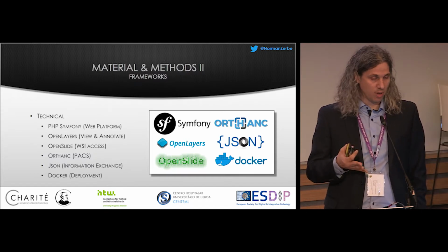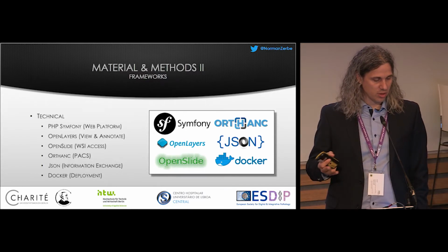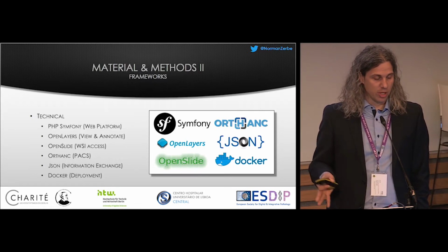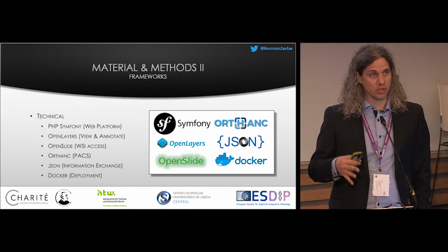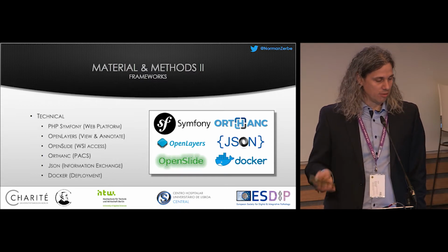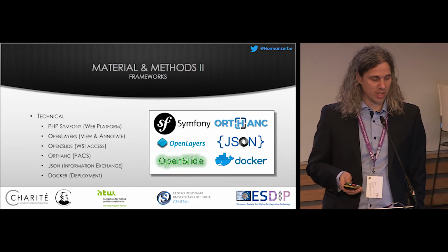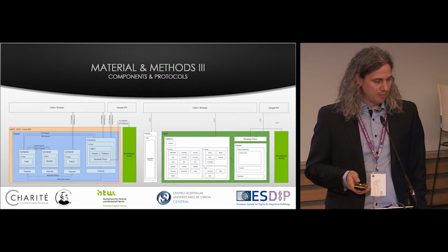Some of them have already been mentioned in the last presentations. Things like OpenSlide, Orthanc as a PACS system, but also for viewing the whole slide images, we used OpenLayers. We used Docker for distributing the different components of the system. For the communication, we used JSON and REST interfaces, and the main platform is based on PHP using Symfony.